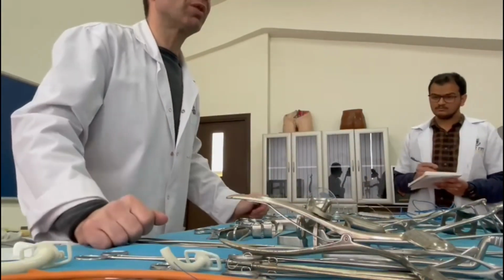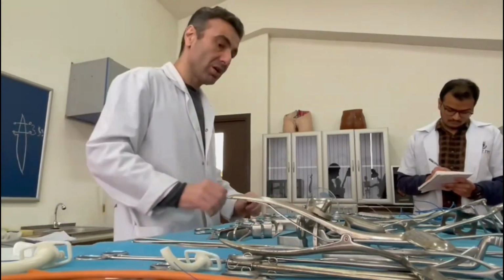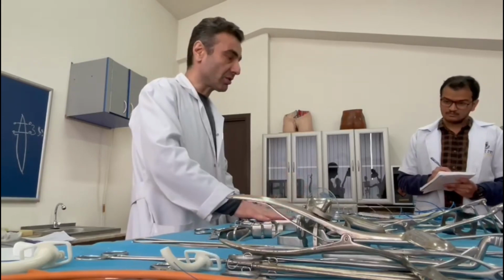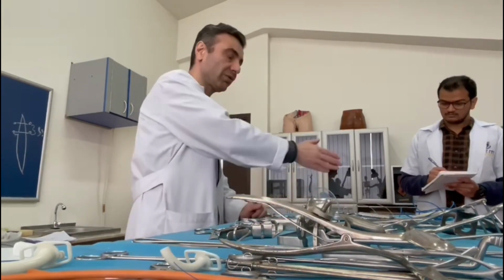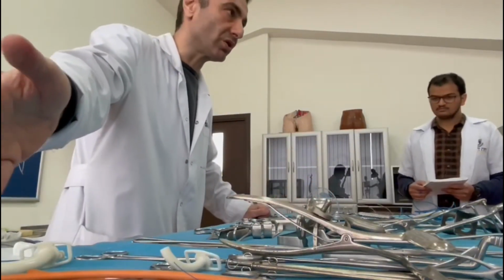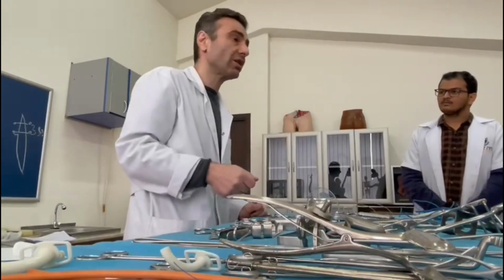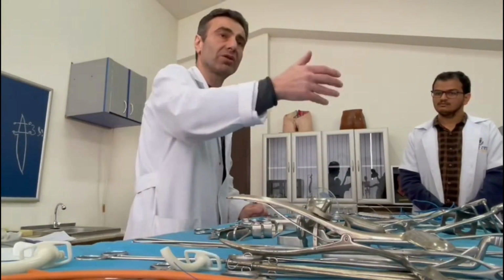Then we come to the meat part of my table. Here we have group number 3 of surgical instruments, which are called general surgical instruments. By the way, before coming to the general instruments, about the second group, I want to tell you that it can be used during the first stage, the second stage, and sometimes the third stage, because when you suture the structures with your needle, you can perforate the vessels, for example, and it can also give bleeding.